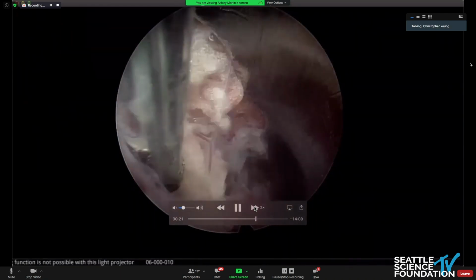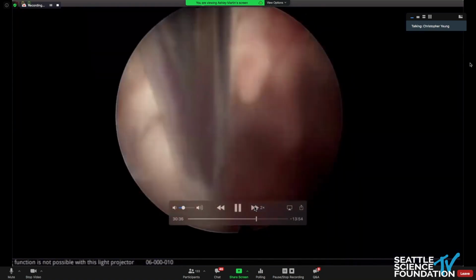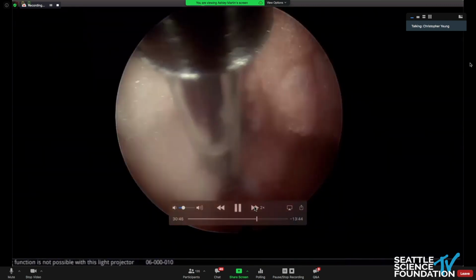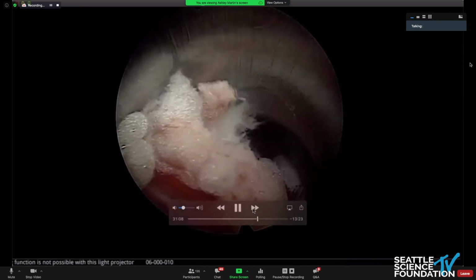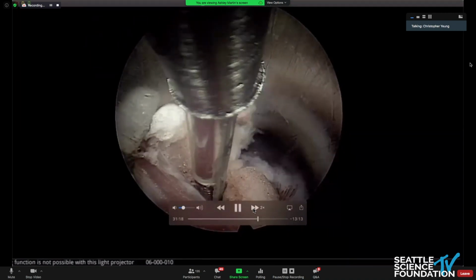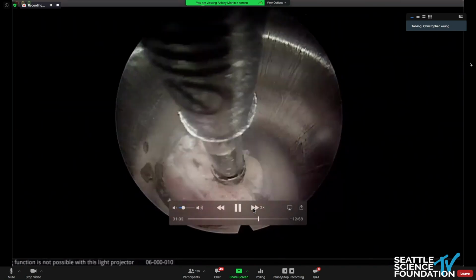Here I'm going to fast forward this a little bit. We're just dissecting. I'm slowly working from the annulotomy towards the exiting nerve root to verify it's decompressed. And I'll expose a little bit more patulous annulus. I'm going to go a little bit faster, 5 times. There's all that stuff. And I'll just keep it on 2 times right here, because basically as we keep working towards the exiting nerve root, you can see the cannula there. Just really trying to verify that the exiting nerve root's free.